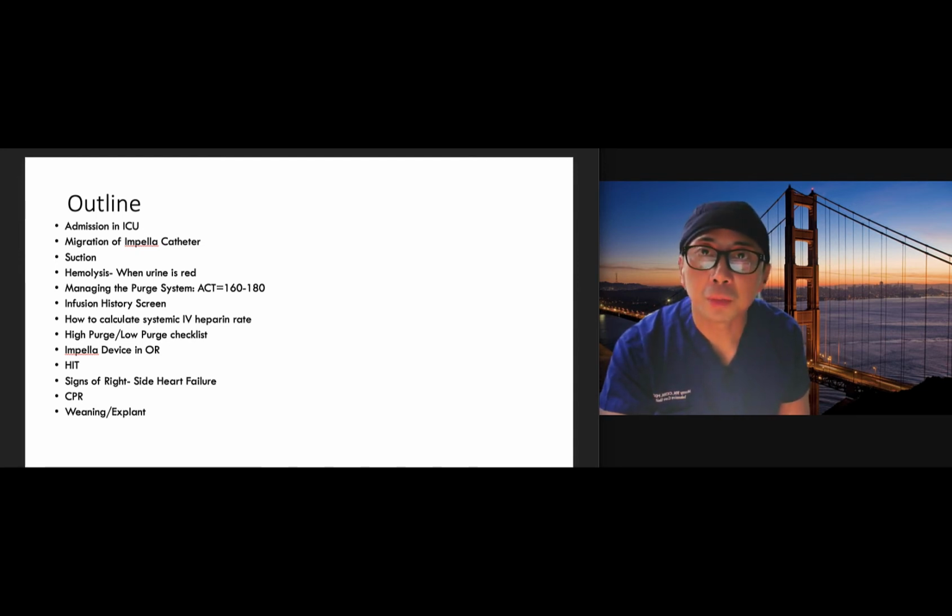What about if your patient develops heparin-induced thrombocytopenia? Abiomed recommends something for us to do. I think they want us to report it. There are some criteria to make it more certain that it is indeed HIT. What would be the signs of right-sided heart failure?